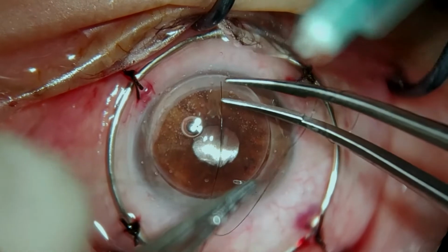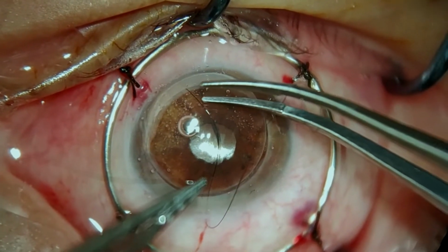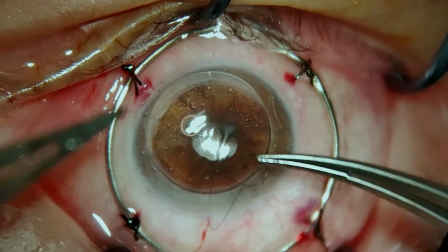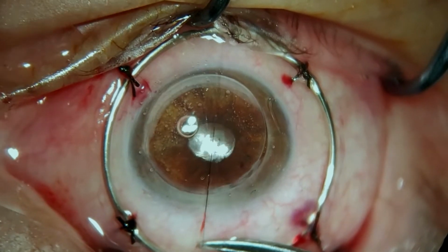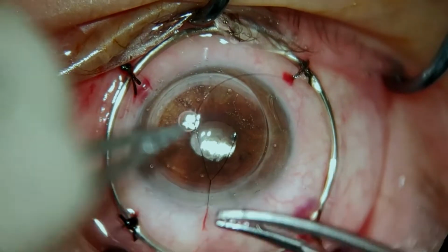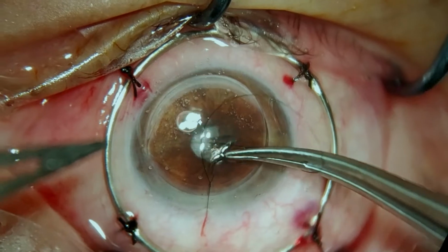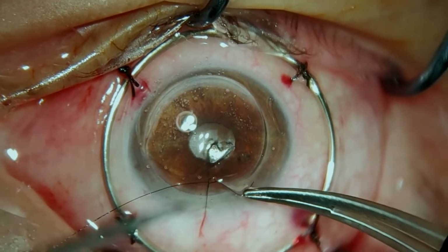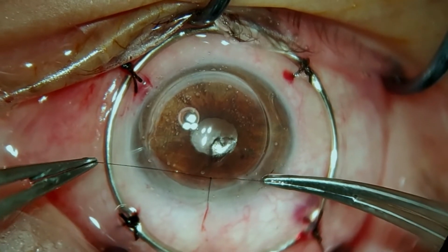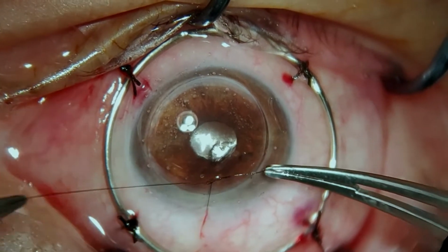Placing the 12 o'clock suture sometimes requires, it's not necessary, but it helps to have Pollack forceps, which is a Colibri with symmetrical teeth, which you pass the needle in between. That means that the cornea will not torque significantly whilst passing the suture. And that's quite an advantage for some of the tougher corneas, like the pediatric corneas we sometimes get. Those are quite rigid and elastic, and it's quite difficult to pass the suture through them.